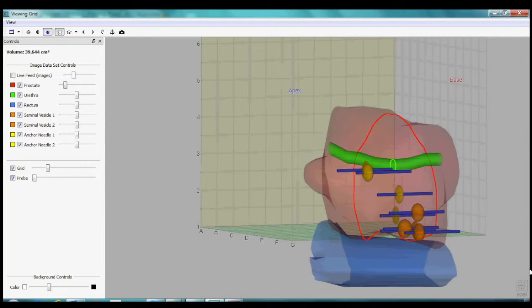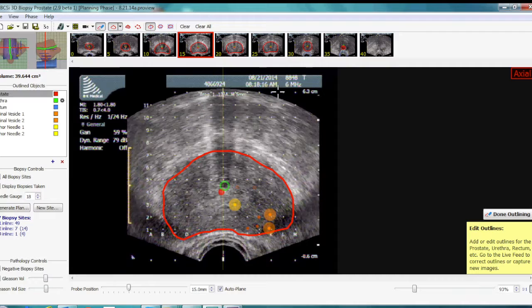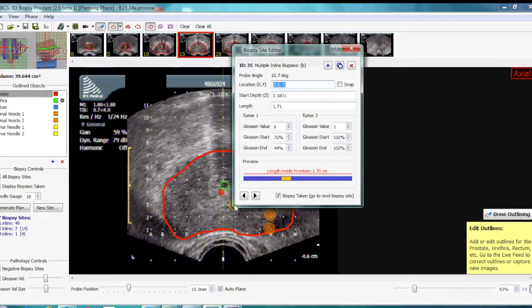The last set of images represent the treatment phase. These individual axial images can be uploaded into a treatment planning system — for example a cryo system, a brachytherapy system, or even a system utilizing IMRT.